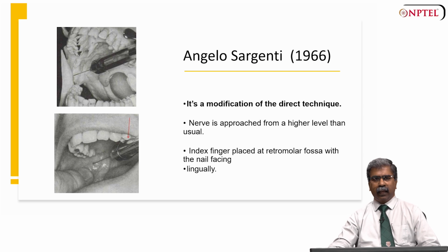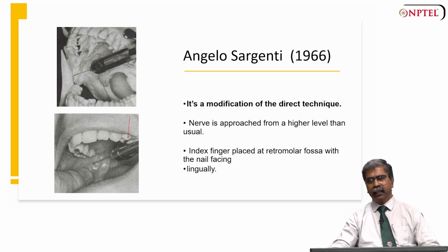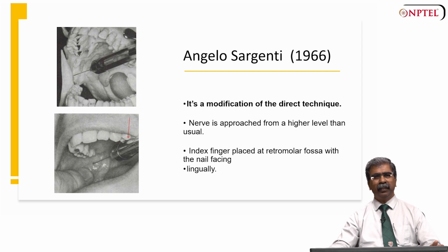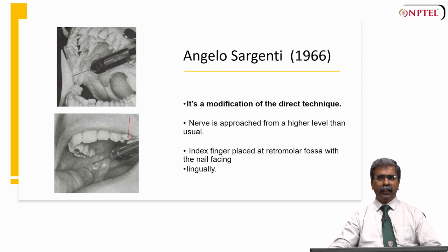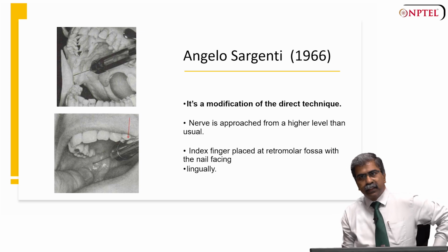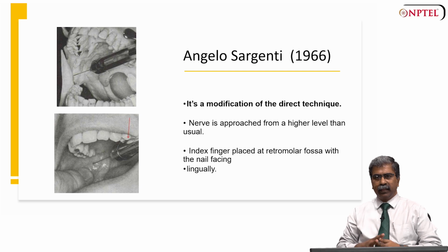This is again another modification of the direct technique, the Angelo-Sargenti technique. It is a variation of the direct approach for nerve block anesthesia where the nerve is accessed from a higher point than in the traditional technique. Just for completion's sake, I have included these techniques. With the higher approach, the nerve is targeted from a higher level, providing a broader anesthetic effect, and it is particularly for difficult cases or when standard techniques are less effective.